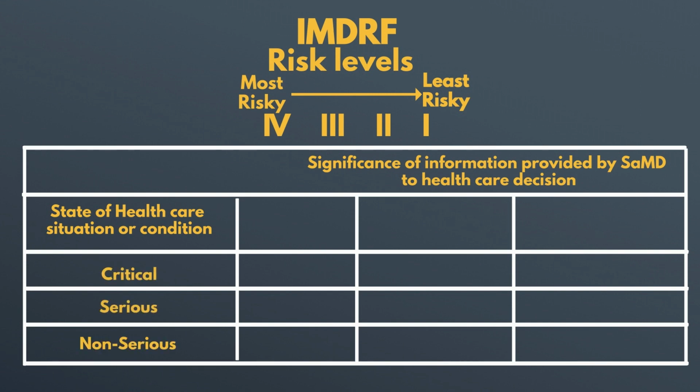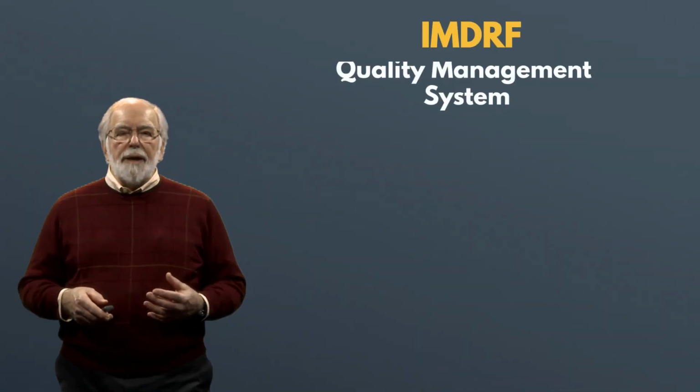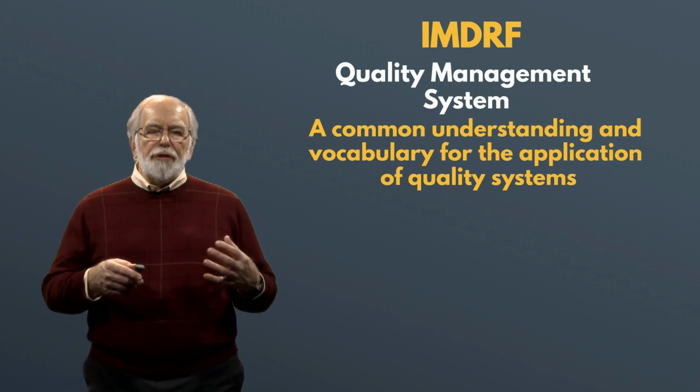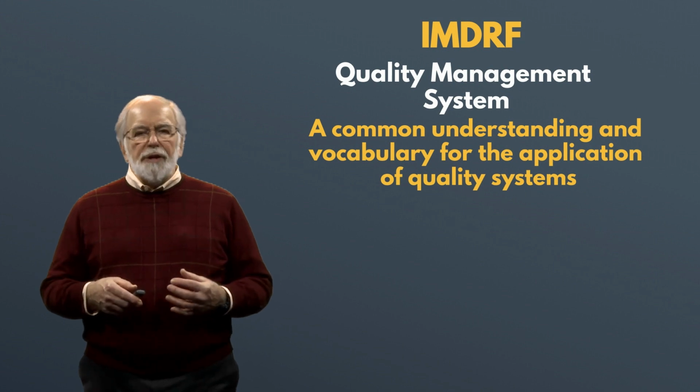And also looked at the different applications for these devices to create a grid that has the different risk levels and how those risk levels are evaluated. And along those lines, they also created a quality management system with a common understanding of vocabulary for the various applications of quality systems that would be used with these types of products.